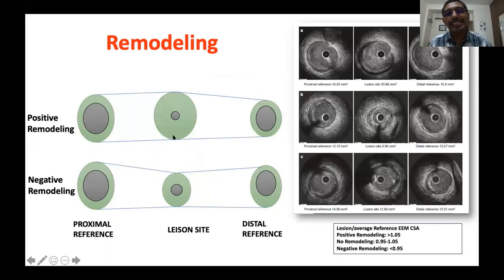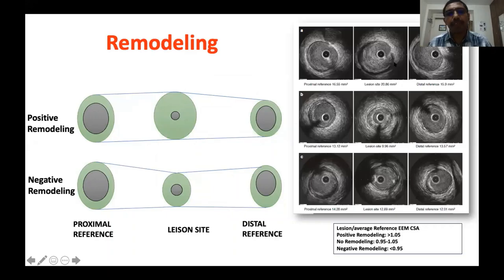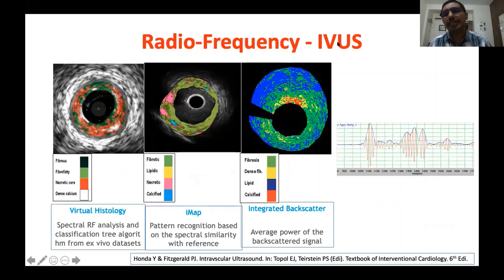Remodeling is a change in vessel size at the lesion site compared to reference segments. If it is bigger it is called positive remodeling; if smaller it is called negative remodeling. Here you see two reference segments where the disease segment is smaller — that is negative remodeling, typically in chronic stable angina patients. Here the disease segment is bigger than the reference — that is positive remodeling, usually occurring in ACS patients.